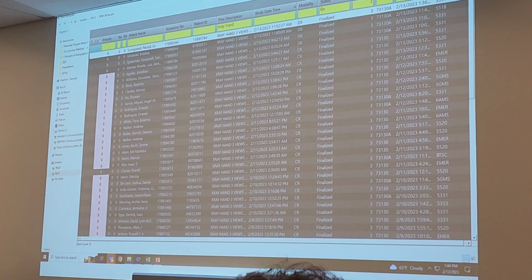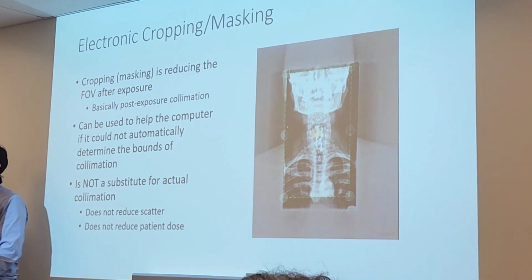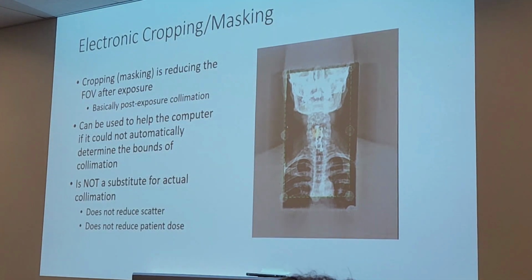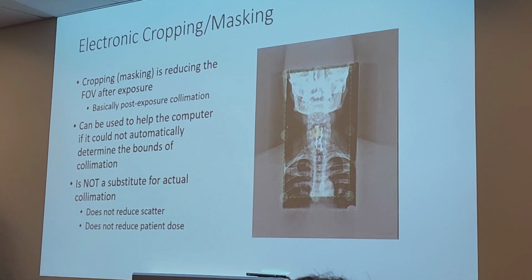Can they also trace back all the post collimation you've done, or can they revert it? They cannot revert it. Thank you for bringing that up. We're going to talk about this at the end of all these post-processing techniques. But when you do post-processing, you have to be very, very careful with what you do, because some of these are irreversible, and you will cause a permanent loss of information if you do them.